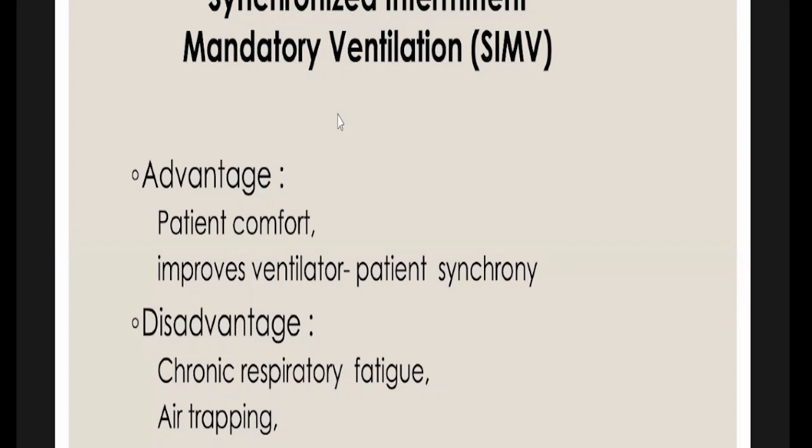Okay, and you also have disadvantages, like sometimes patients get so fatigued while being on synchronized intermittent mandatory ventilation. There will be a lot of air trapping as well. And patients tend to hyperventilate sometimes, which will again exhaust them.